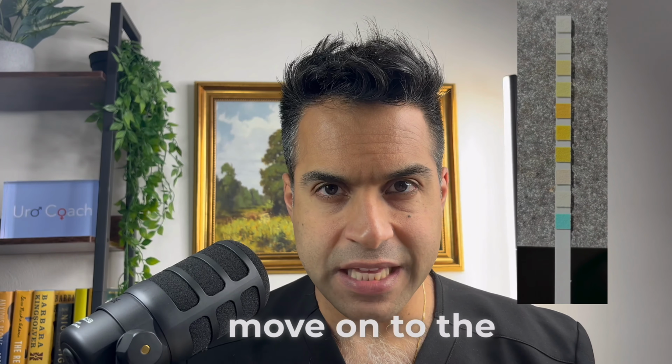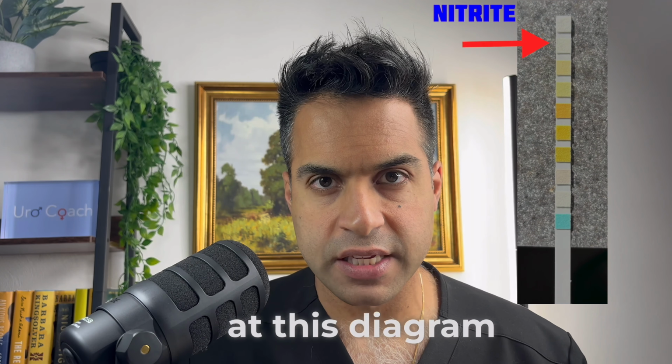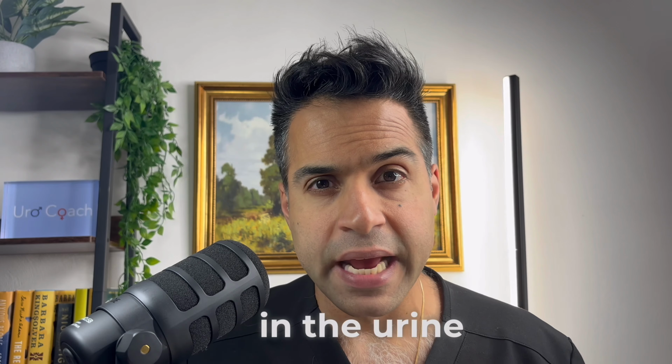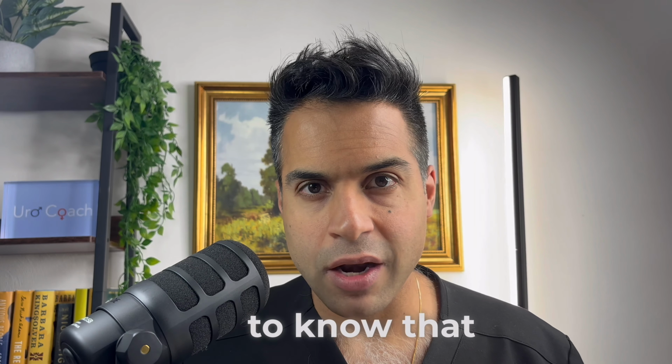Okay, so I want to move on to the next one, nitrite. So nitrite is not normally in the urine. If you look at this diagram, that's where you see nitrite on the urine dipstick, okay? So nitrite is formed when nitrate, which is typically in the urine, is converted into nitrite by nitrite-forming bacteria. It's important to know that all bacteria do not form nitrite.